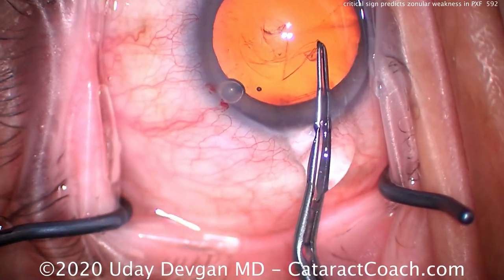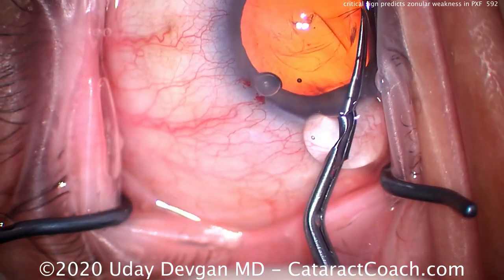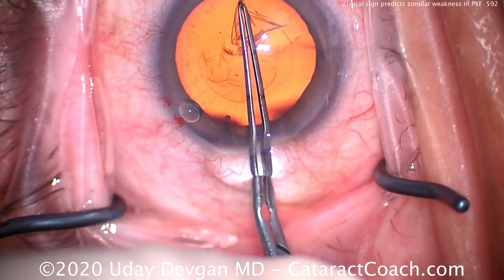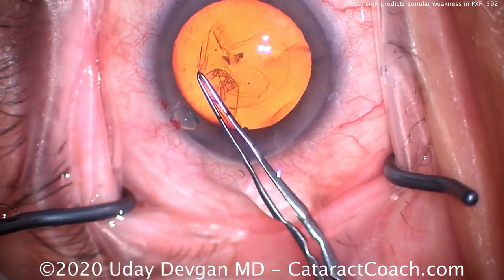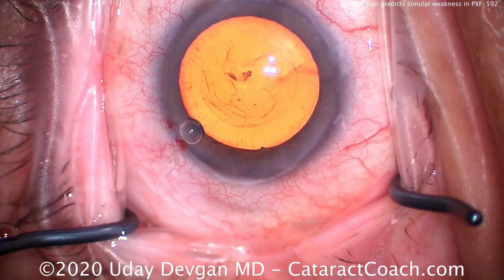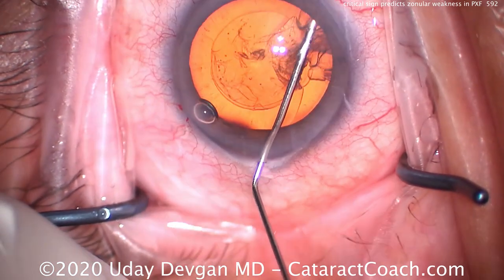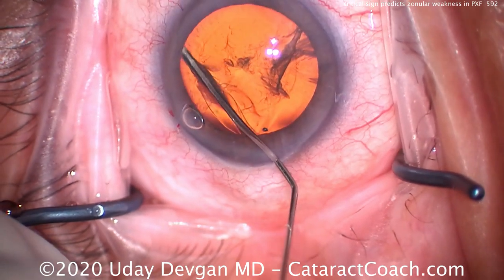Now we know we're going to have reasonable zonules, but what were the clinical signs we could examine in the pre-op clinic? What signs would let us know about zonular weakness in pseudoexfoliation? The answer is two things. One is the degree of dilation — if the pseudoexfoliation is relatively mild, the pupil will dilate beautifully and the zonules will probably be pretty strong. That's this case: normal zonules, no weakness at all.